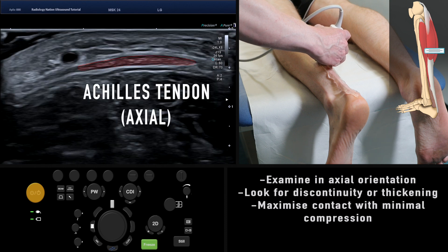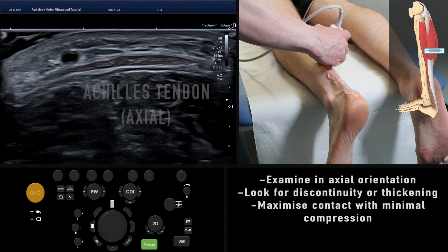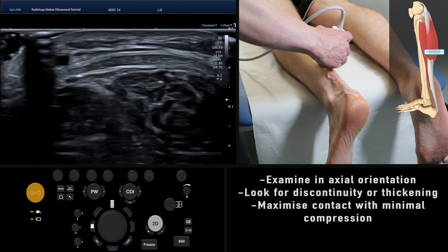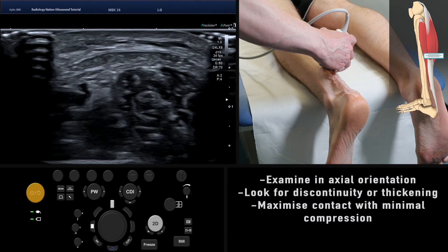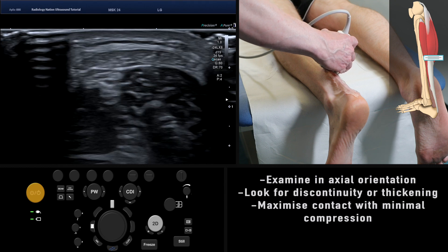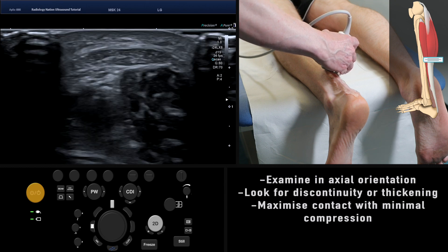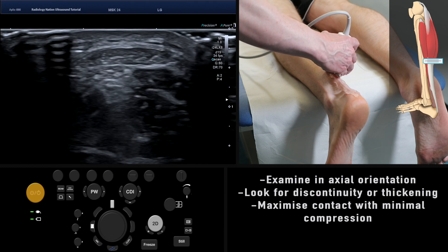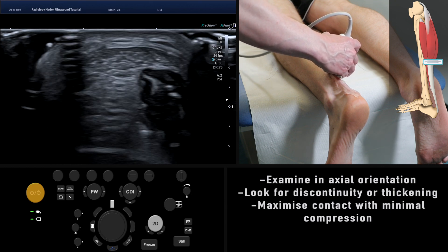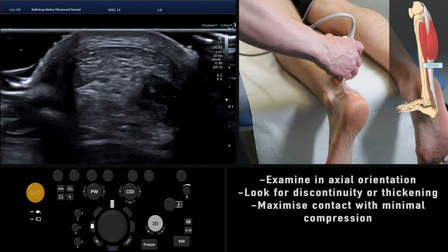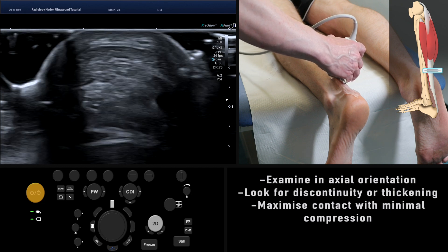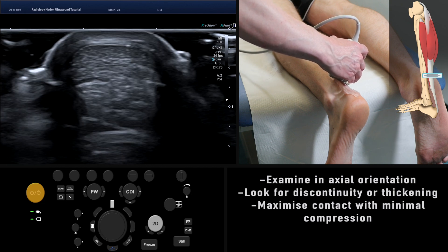It is advisable to keep downward compression to a minimum while still maintaining adequate contact between the probe and the skin. To achieve this, apply a large quantity of aqueous jelly to the scan region and to the surface of the probe. Loss of contact can easily mimic or mask pathology.